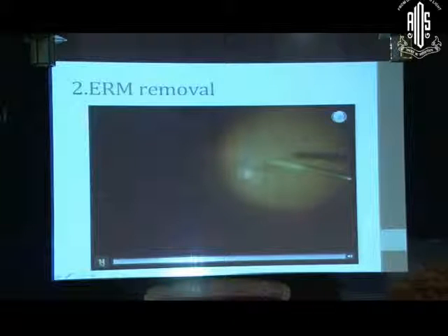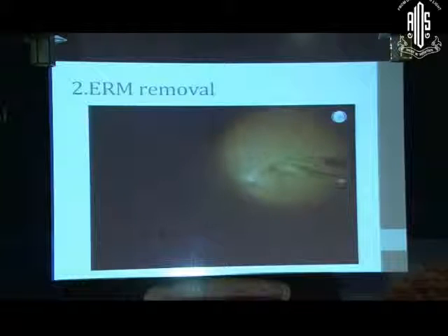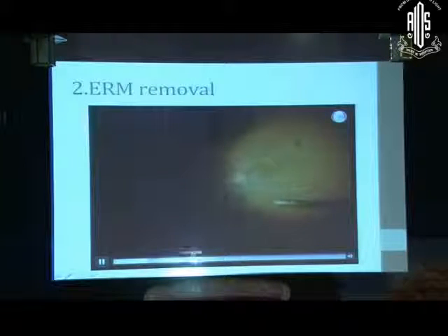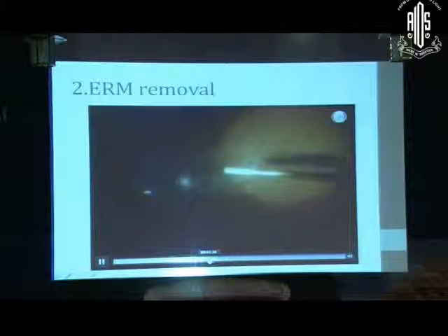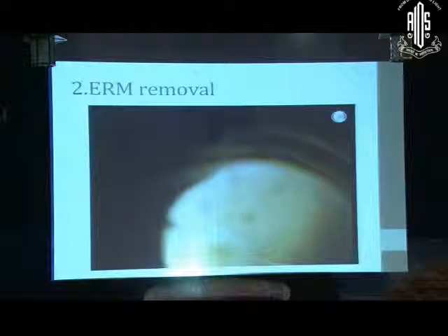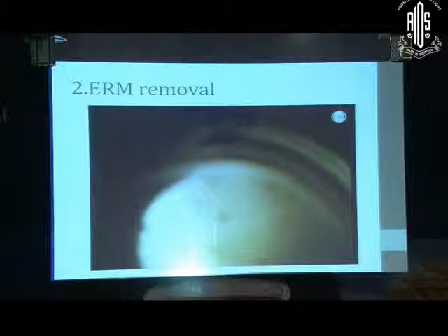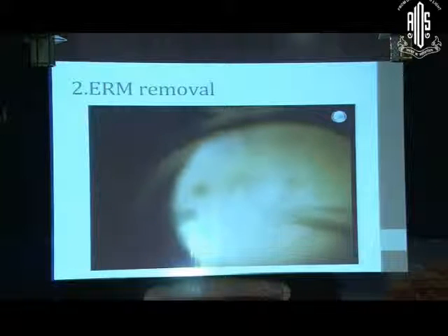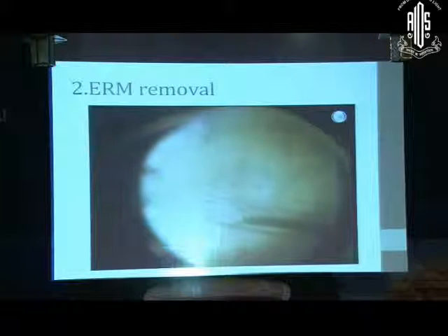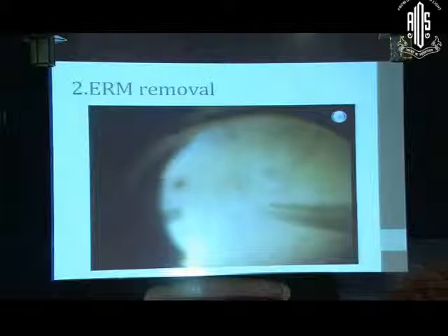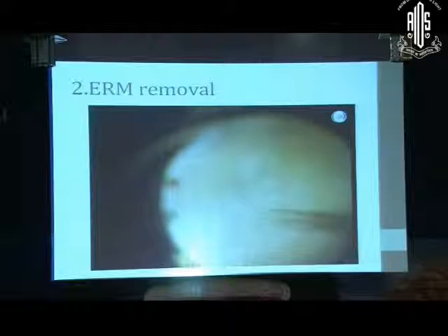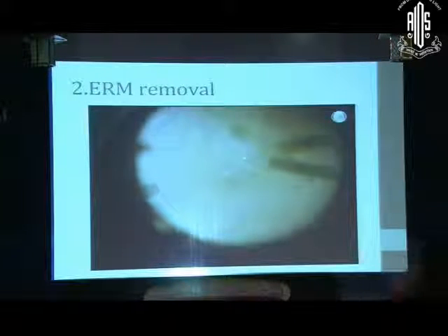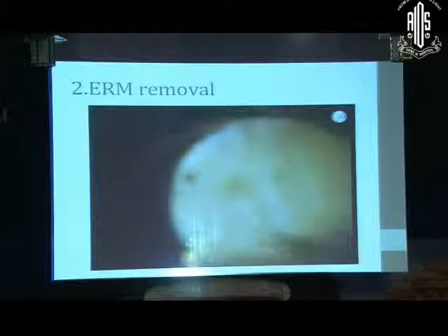The second step: many of these patients also have an epiretinal membrane or a premacular cortex. This is a patient with VMT — we induce the PVD, and after induction we stain and find there is a lot of premacular cortex. Stained with brilliant blue, we see it was negatively staining, so we remove this first. One needs to take care because vitreous schisis is extremely common in diabetics. Just inducing PVD is not going to release the traction — you also need to remove the premacular cortex, which is very adherent to the fovea. I separate it all around and then lift it out from the foveal attachment last.